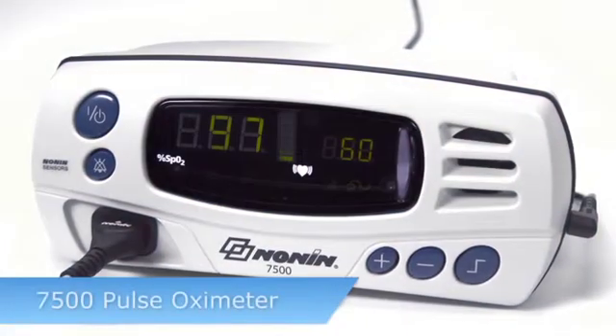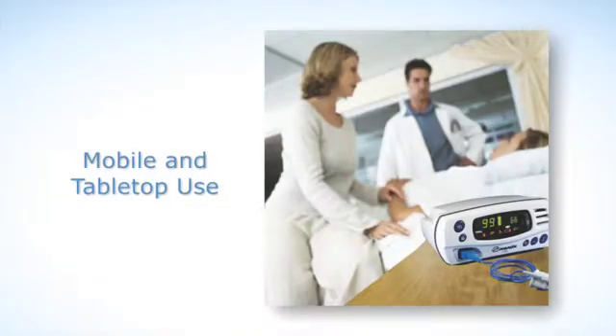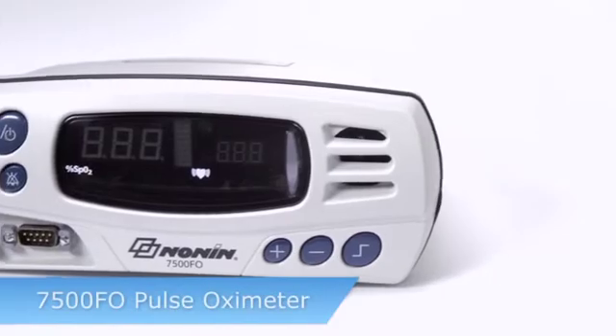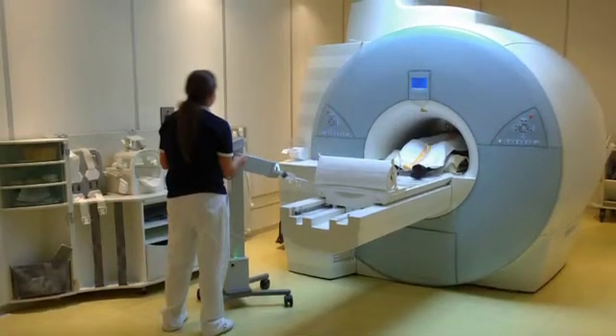The 7500 pulse oximeter model is designed for mobile and tabletop oxygen saturation and pulse rate measurement, and is compatible with a full range of pure light sensors from Nonin Medical. The 7500 FO model is specially designed for use in magnetic resonance imaging environments.